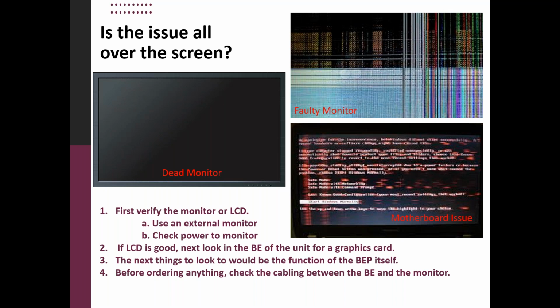And I can tell you that we've had multiple situations where we've ordered an LCD and sent it to an FSE, and it turns out he's got a bad monitor cable or a bad video cable or power cable to the monitor.